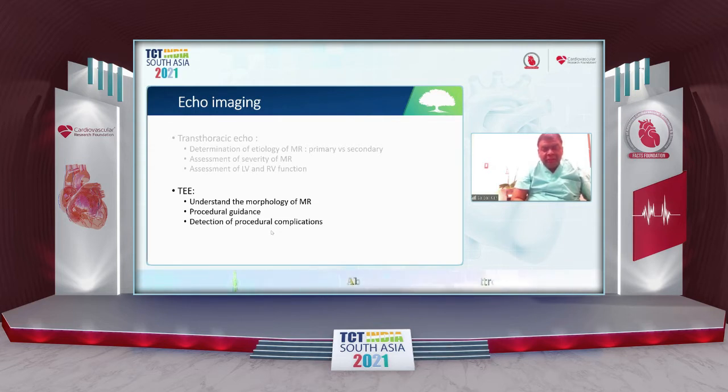I would say that in this procedure, and Saibal, you agree with this, the role of the echocardiographer is as important as the interventionist, or even more. If you don't have a good echocardiographer helping in the procedure, you just cannot do it. Samir, do you agree with that? I completely agree. Though Samir likes to do a lot of fluoroscopic imaging, I still think TEE is very important.